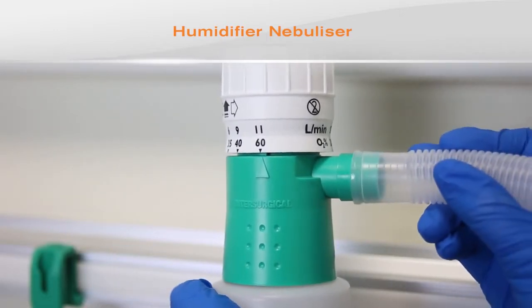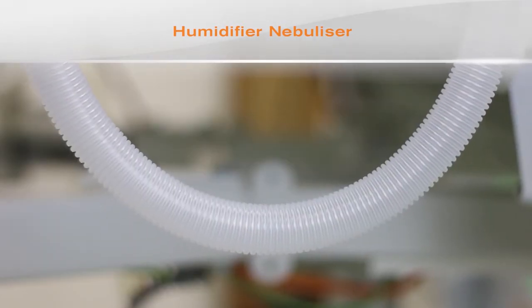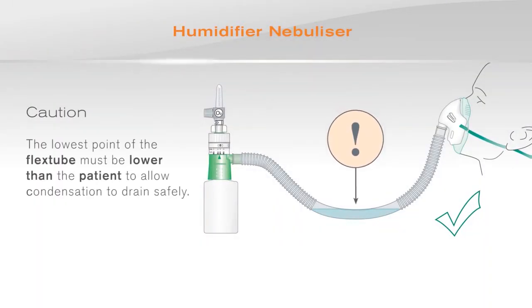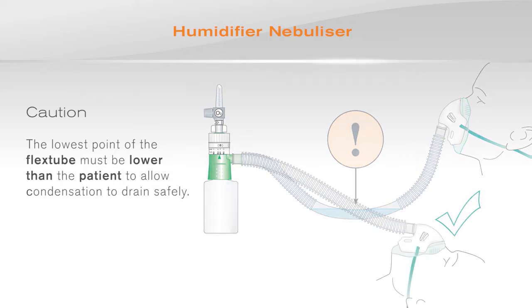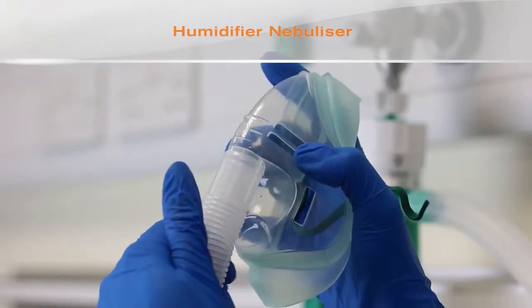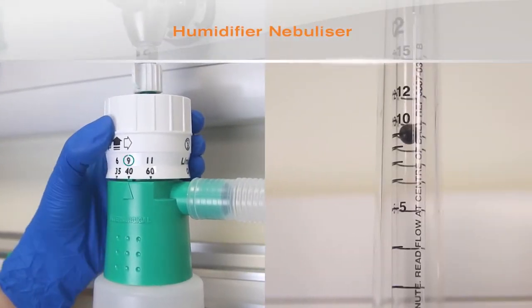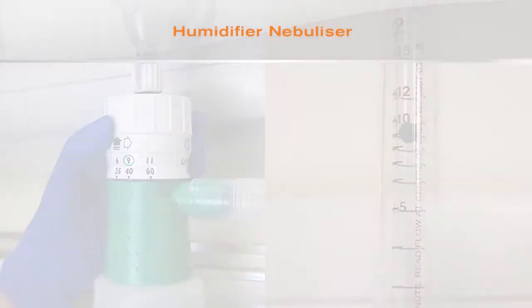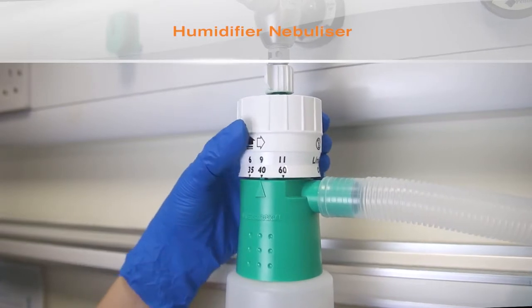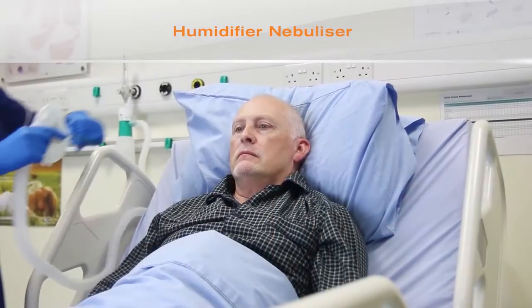Attach 22mm flex tube to the outlet of the humidifier nebulizer. It is important to position the tubing so that the lowest point is below the patient and to regularly drain any condensate to prevent any condensed water from running into the patient or occluding the flex tube. Attach the aerosol mask and then adjust the oxygen concentration to the required level. Set the flow meter to provide the required total flow to the patient. The Intersurgical Aquamist makes this simple by indicating the appropriate flow above each oxygen setting. Then fit the delivery device to the patient.